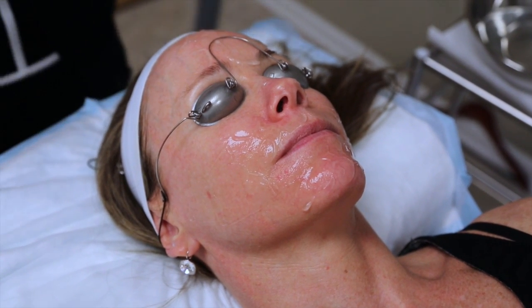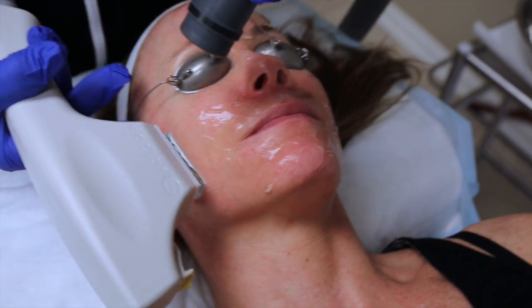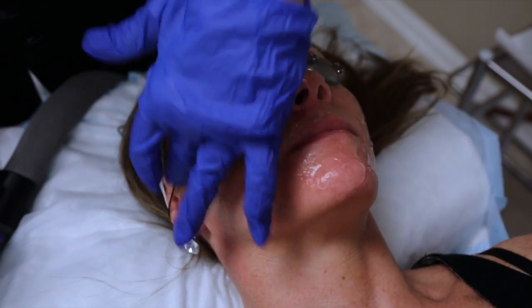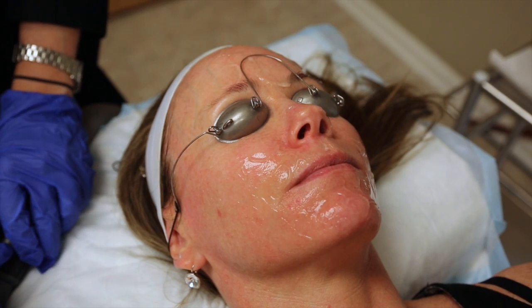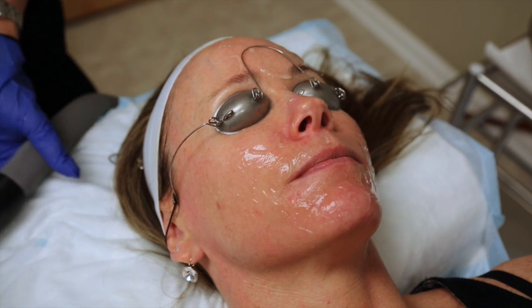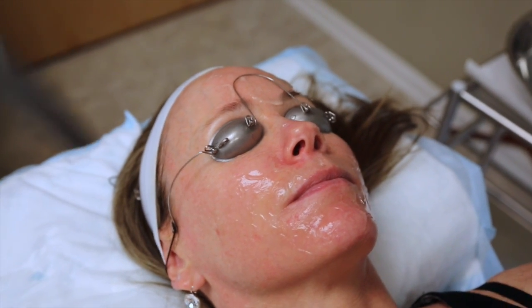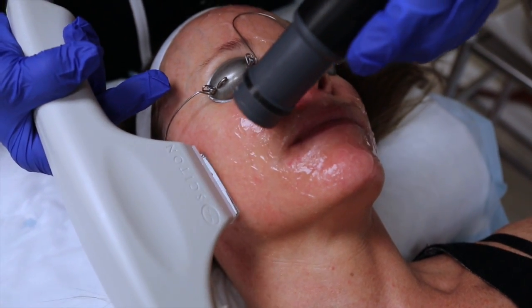I like to blow cool air on the skin while I do the procedure because it's more comfortable for the patient. So what I'm doing first is a spot check. So I'm checking my standards and my settings to make sure that they're safe and they're going to be effective. How was that? Fine? Okay. So we see a nice pink color, so that's a good setting. And then I proceed.